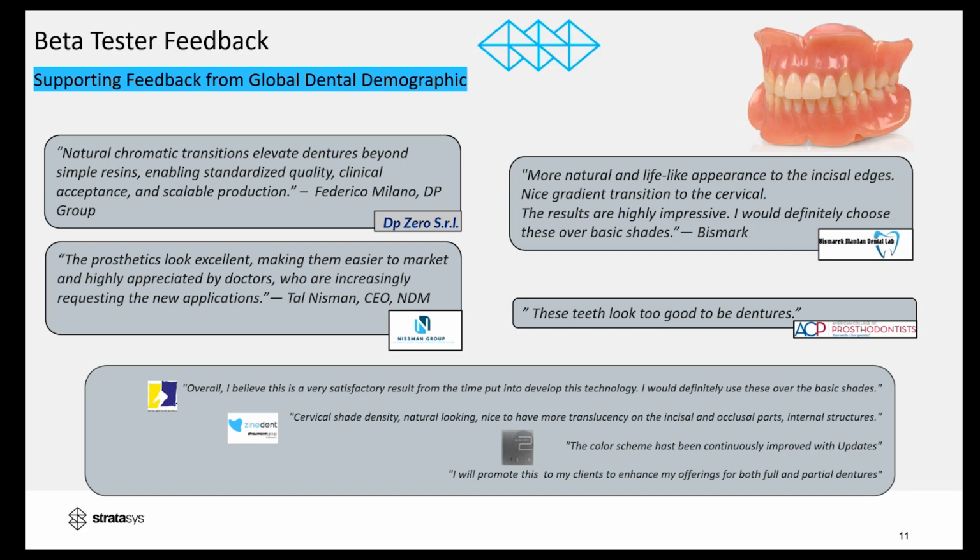Regarding curing time and processing time, no difference. The same curing time and the same processing time as usual. Clear results or fully clear prints sometimes require longer curing time. If you want a better result, this is up to your taste. If any one of you had some experience with printing fully clear models, you can see that longer curing times can get you a clearer result. But from our test, the regular curing time gets you a very good looking result just out of the bat.